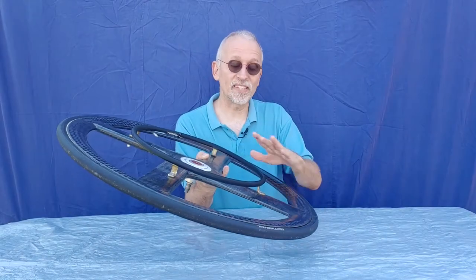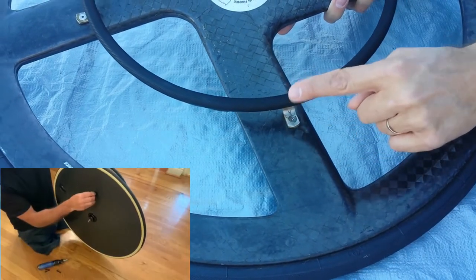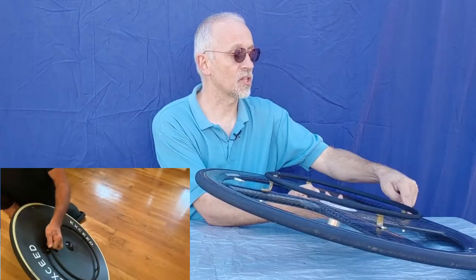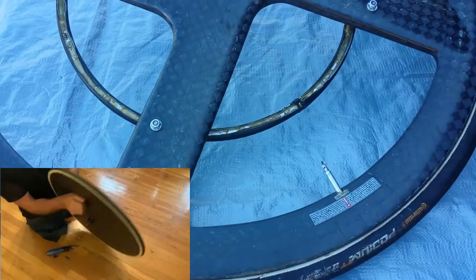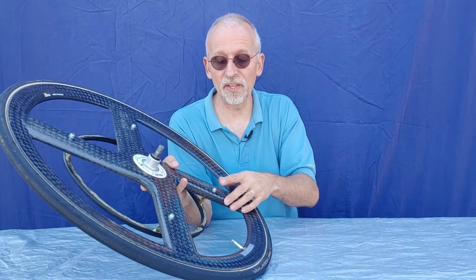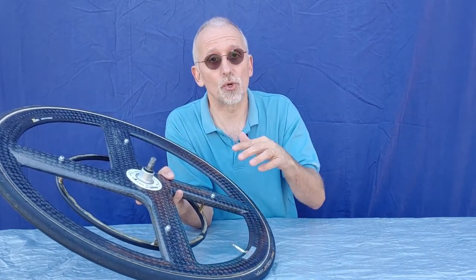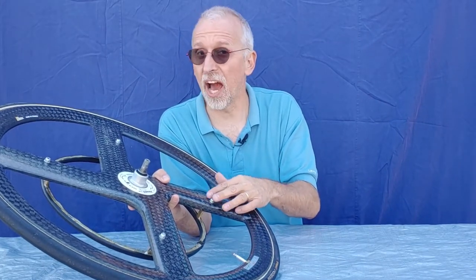To reattach the hand rim on a carbon fiber wheel, line up the holes in the brackets on the hand rim to the holes in the wheel. Slide the bolts through in all four places, then put the washer and nut back on and tighten them up. This is very important: when you tighten the nuts on the back side, you don't want to over-tighten them so that you crack the carbon fiber. They need to be firm but not over-tightened.